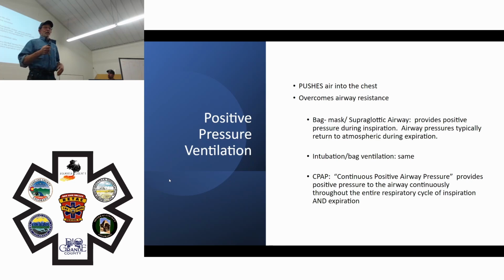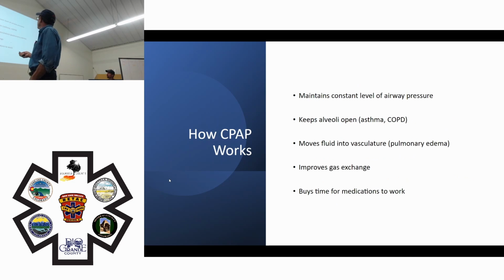So you've got augmentation of positive pressure with inspiration. You've got expiration actually occurring against a little bit of positive pressure. We're going to talk in just a moment about why that works and why it's so important.